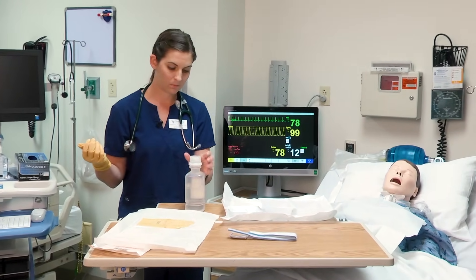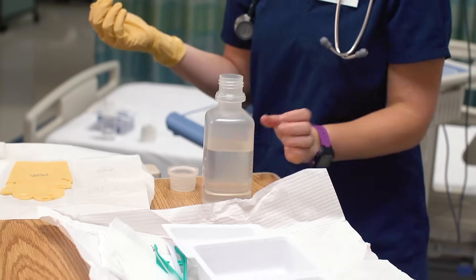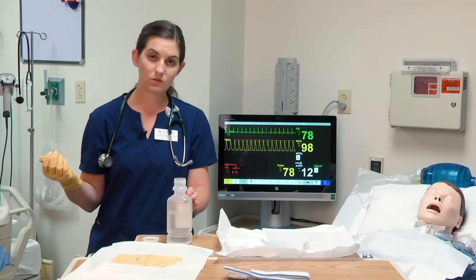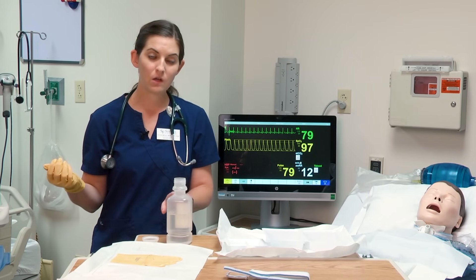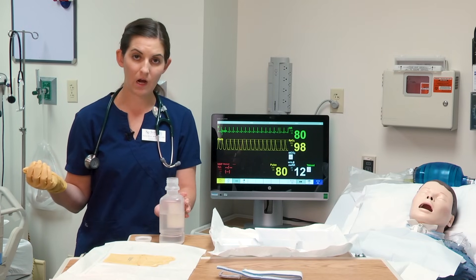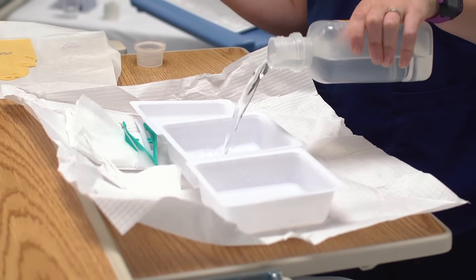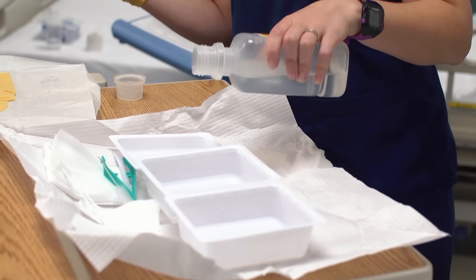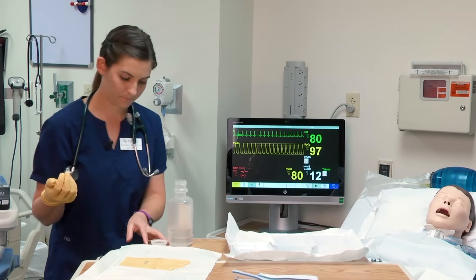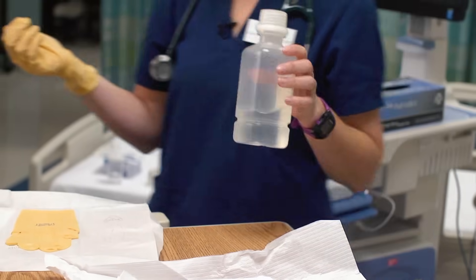Then I have my sterile normal saline. I'm going to put my cap facing up. When you first pull out your supplies, make sure the bottle has not expired. If you are the first to open this bottle, label it with your initials, the date, and the time it was opened. Most institutions have a 24-hour policy — after 24 hours this is no longer considered sterile. I'll pour into my second and third containers, avoiding splashing. If you splash and wet your sterile field, it is considered non-sterile.